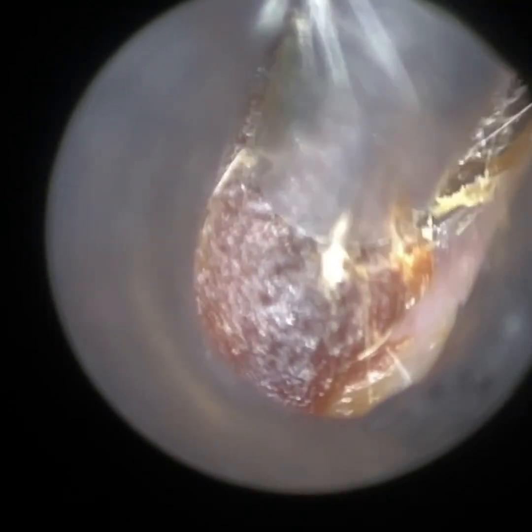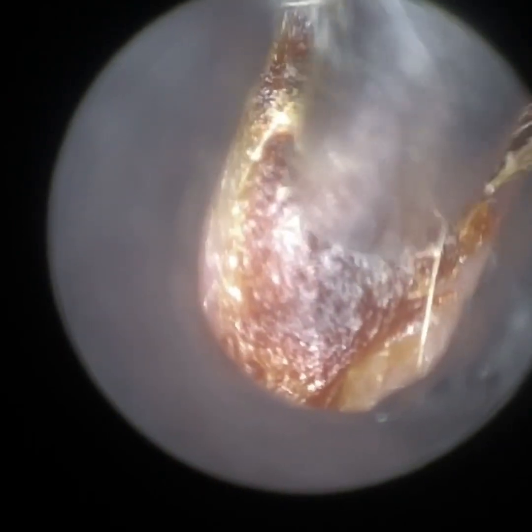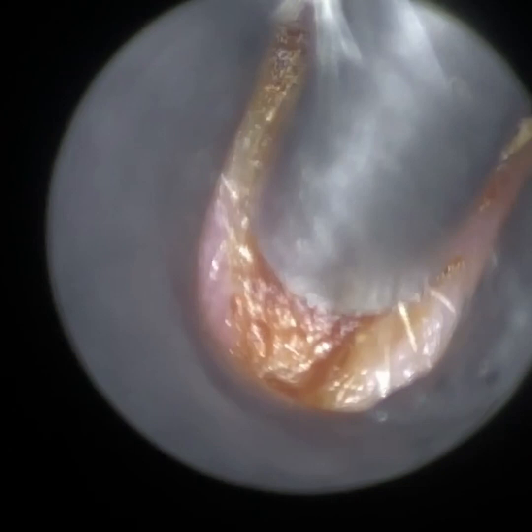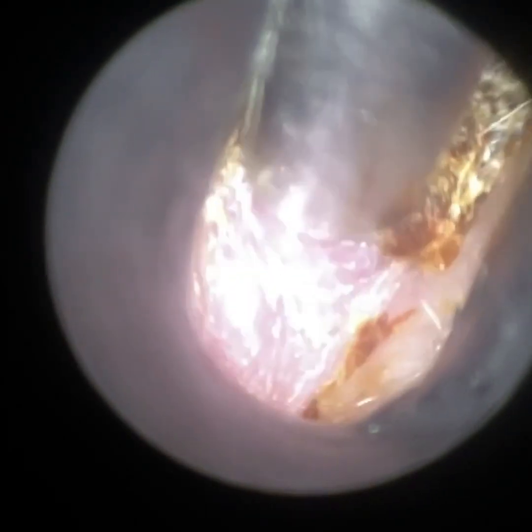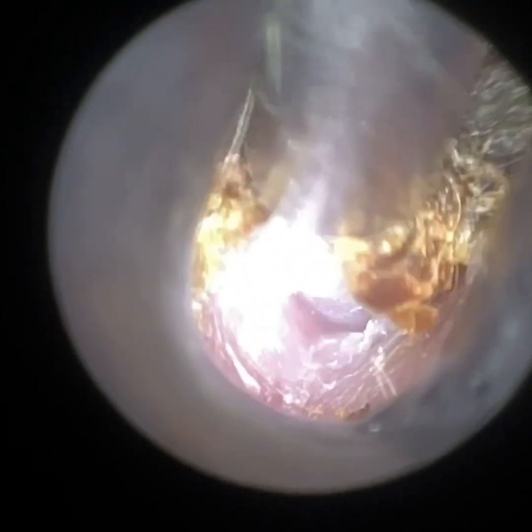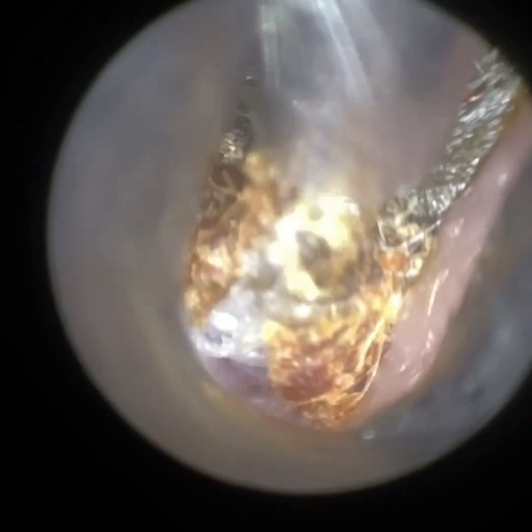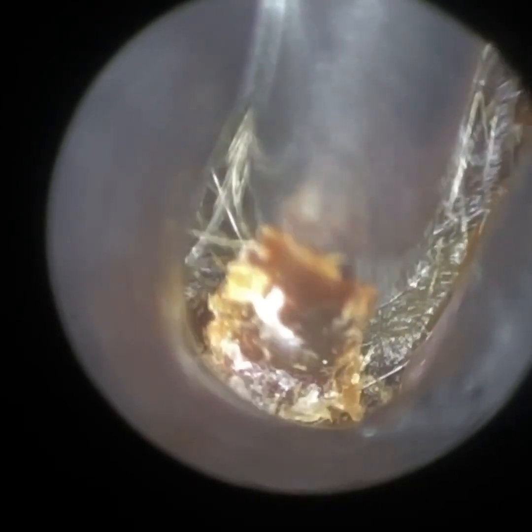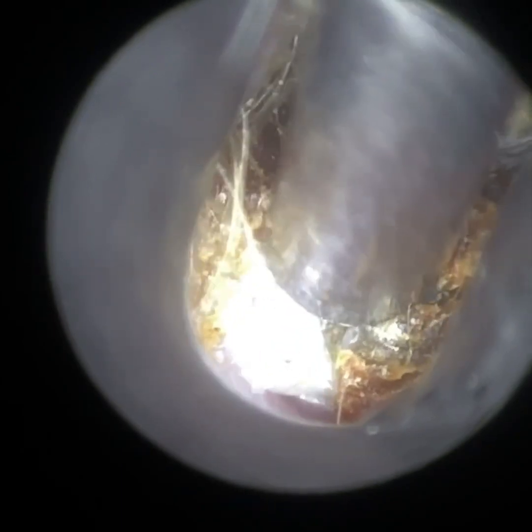So I'm using our smallest speculi size here, which is the 3.5mm bore speculum. Not only has the patient got a really narrow ear canal — you can actually see here the suction probe is just about fitting within the ear canal. Considering the suction probe is 2.2mm in diameter, there's very little space within the ear canal. Of course, the ear canal's oval shape, so the height is significantly greater than the width.